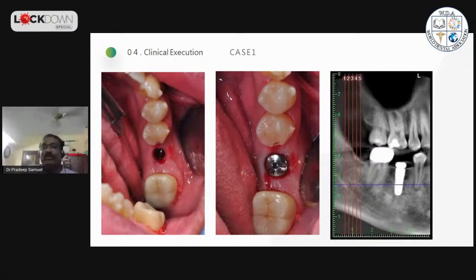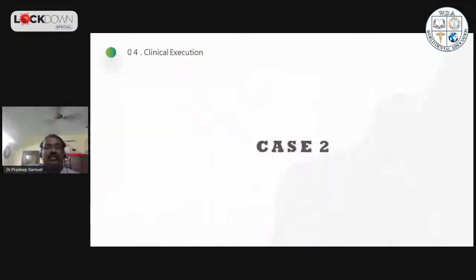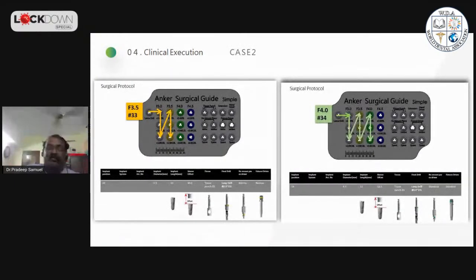for your prosthetic. It becomes very easy if the implants are placed really parallel in your prosthetic phase. Otherwise, it's really difficult if your implants are placed angulated. It's really difficult even for your impression taking. So if your implants are really parallel enough, it is really good. So this really comes in handy when it's in multiple implant cases.